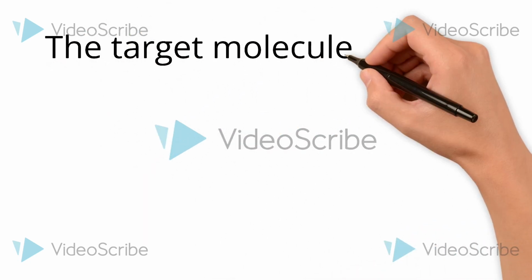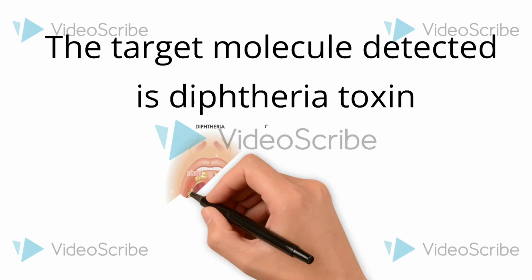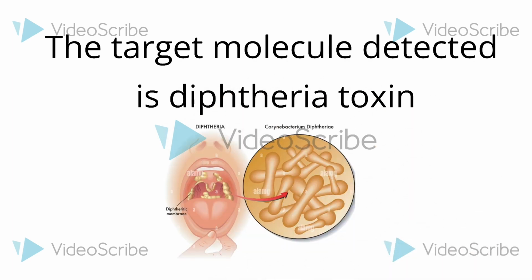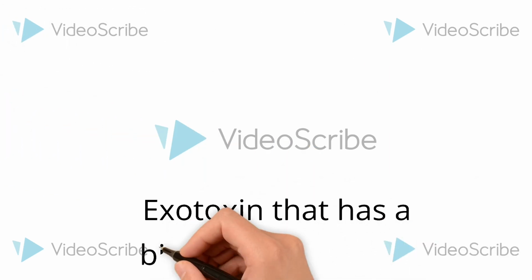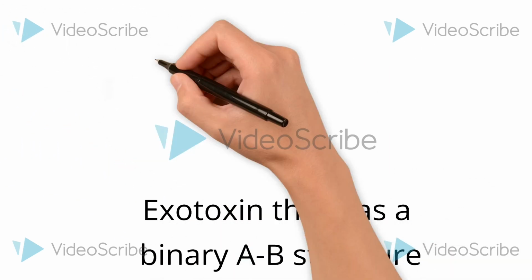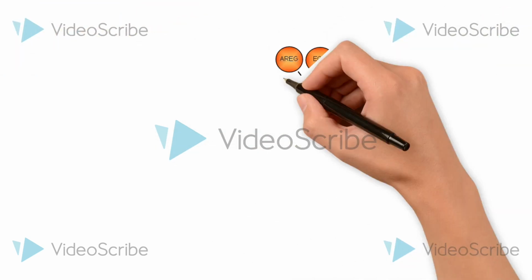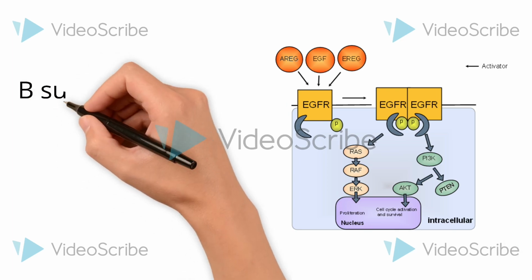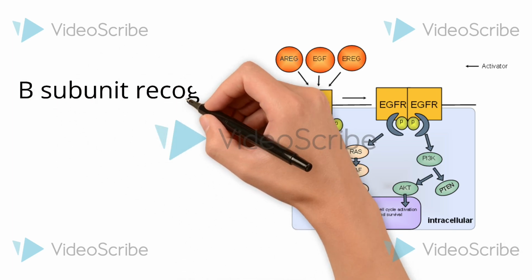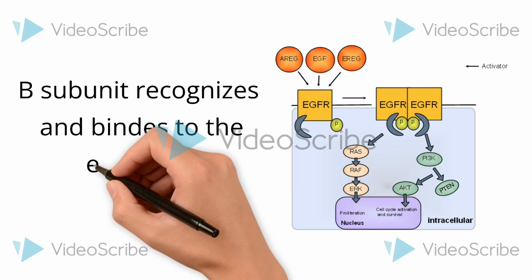The target molecule detected by the strip-based immunochromatography test is the diphtheria toxin, produced by the toxigenic strains of Corynebacterium diphtheriae. This diphtheria toxin is a protein-based exotoxin that has a binary AB structure. The B subunit is responsible for recognizing and binding to the epidermal growth factor receptors on the surfaces of human cells, and this facilitates the internalization of the toxin.